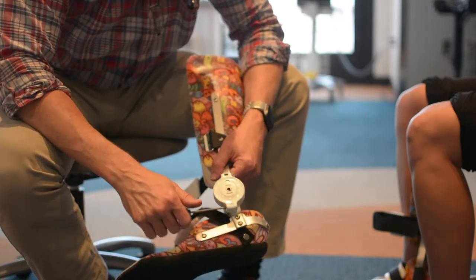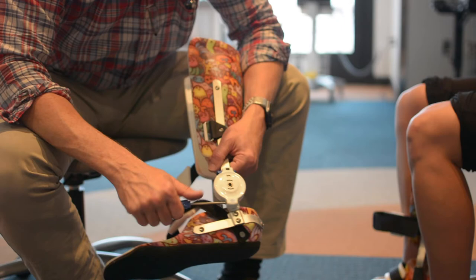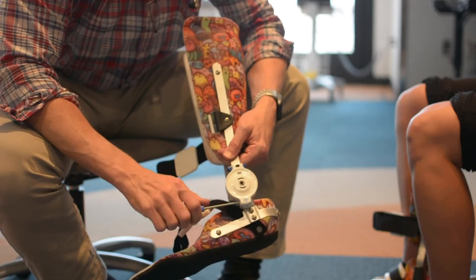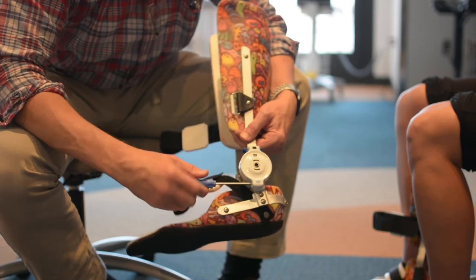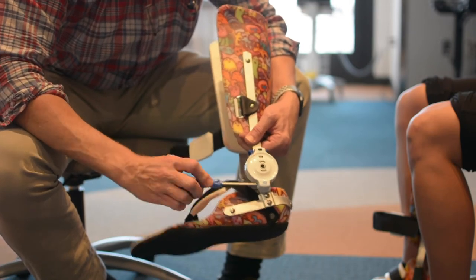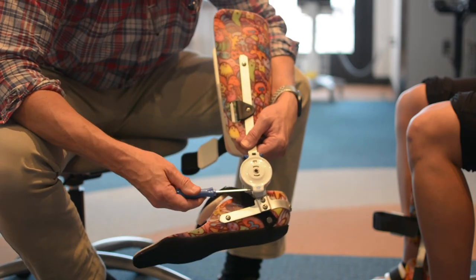As I move through the tensions, I go from three to three and a half, up to four. I can move these and as you can see it takes quite a few turns to get the number to move a whole value. I can also go counterclockwise to cause the tension to come back down in value as well.